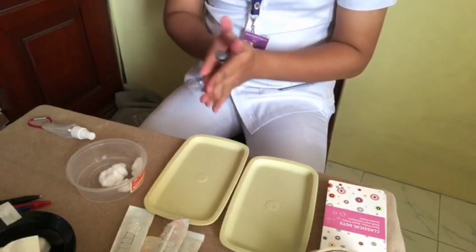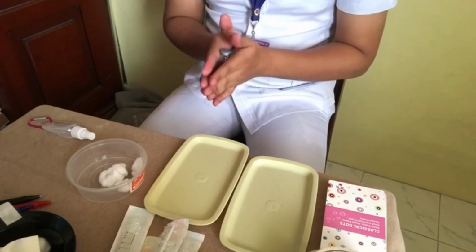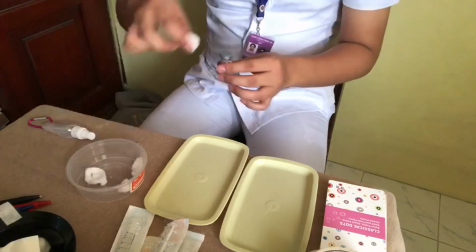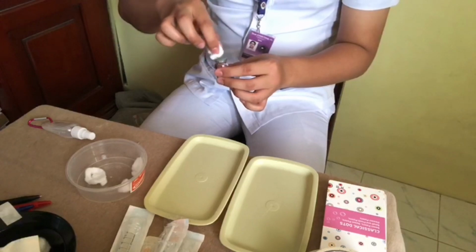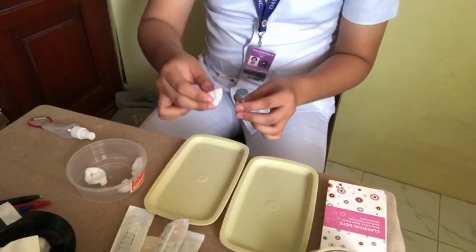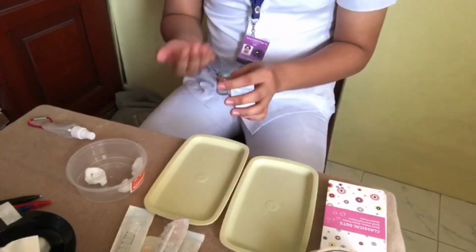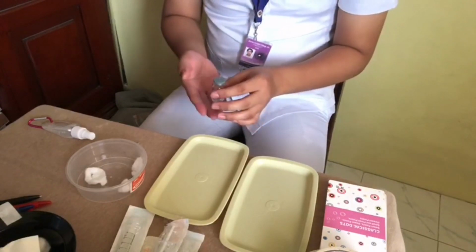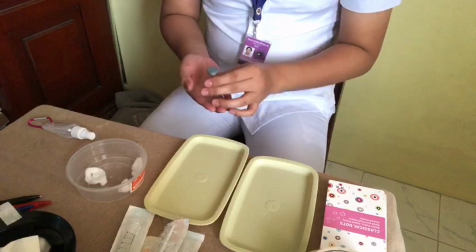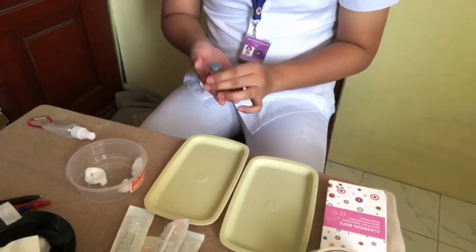After that, we'll remove the protective cap of the vial and clean it with an antiseptic wipe by rubbing in a circular motion. I'm going to pick a cotton ball and wipe it in a circular motion. After that, discard the cotton ball. Wiping it with the antiseptic will disinfect its lid and prevent cross-contamination. Now the medication is ready to withdraw.